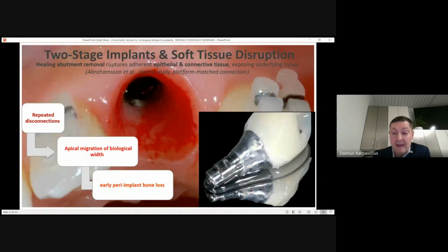And I would like to say that in our daily practice, while we're using this type of Conometric treatment, peri-implantitis is so rare. We find it very rarely, including because we are not doing a lot of augmentative procedures. Augmentative, not only bone, but what is very important, soft tissue procedures. And especially not only maxilla, but mandible. Mandible is very sensitive for this.